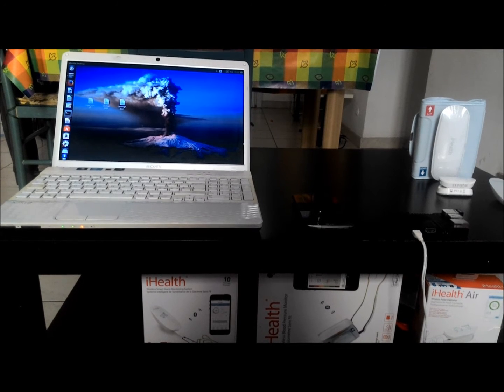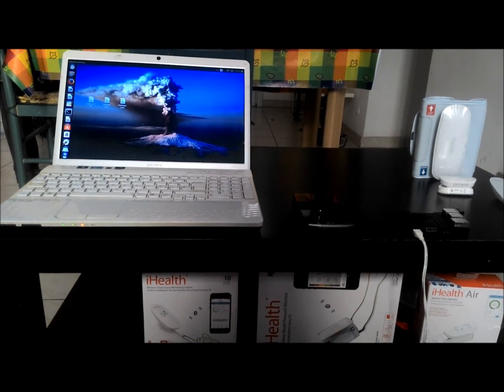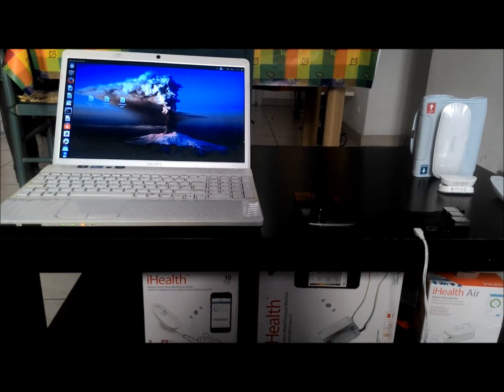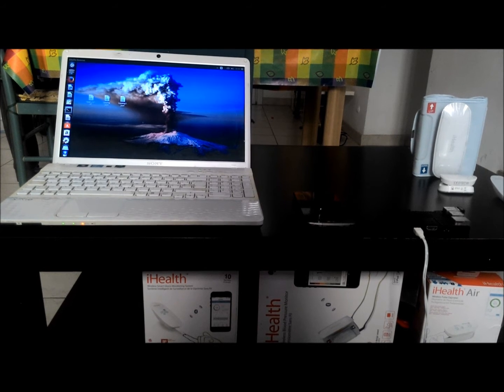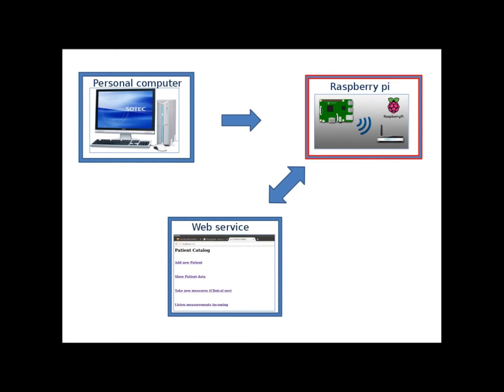It contains all our application scripts and it will work as a remote server. Then we have our smartphone, on which we have installed the iHealth app, and on the left a standard PC with an executable file. This is basically how the system works. A personal computer connects to the Raspberry Pi and runs the web service Python script, which is accessible to the PC and through which it can control the program in the Raspberry.